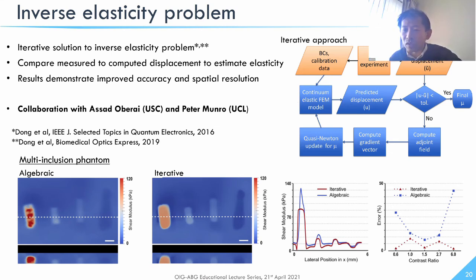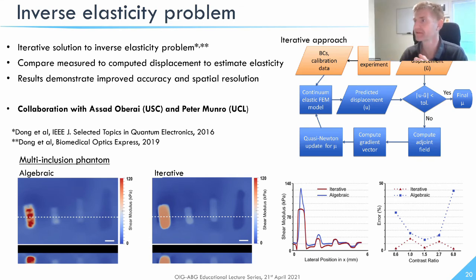His question was, the extracellular matrix is not considered a linear elastic material and can exhibit more complex mechanical behaviors, including viscoelasticity, mechanical plasticity, and nonlinear elasticity. How do you cope with that in vivo, in situ? Great question.